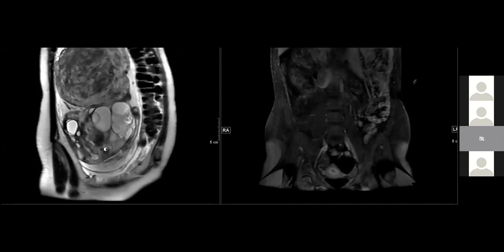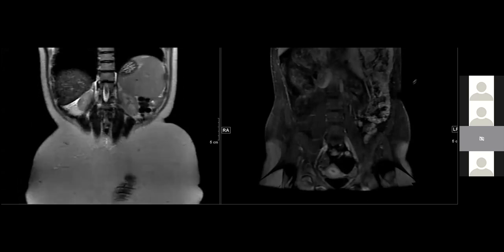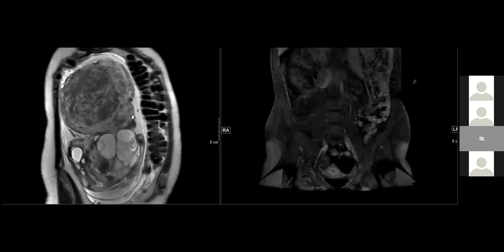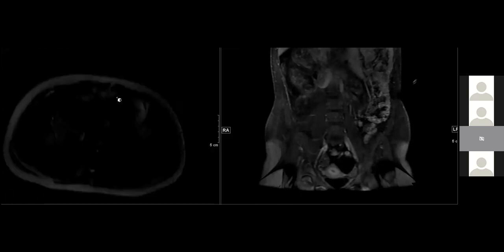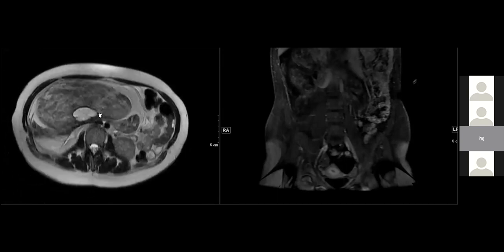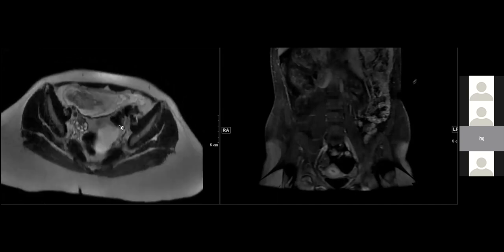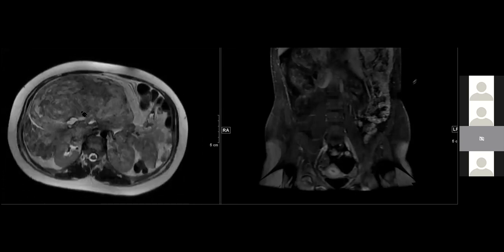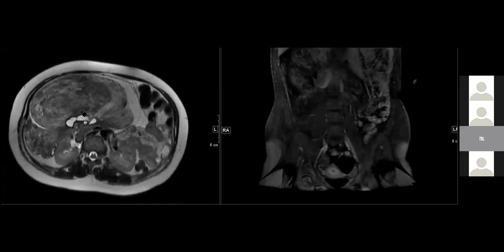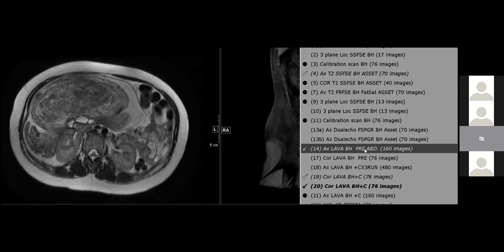I have a couple of theories, but one of them, I have a couple of solitary fibrous tumors that look like this. And then I also have a fibroma, but if the ovaries are normal, then no. So we could not, here's the left ovary, here's the right ovary. So we thought this was arising from retroperitoneum and just recommended resection. At least I believe that's what happened.